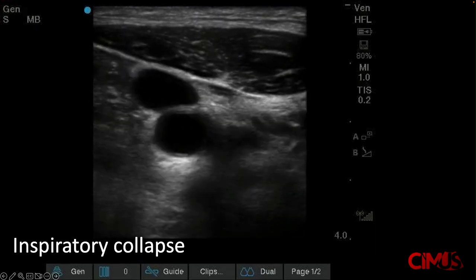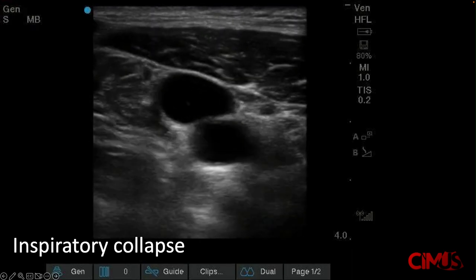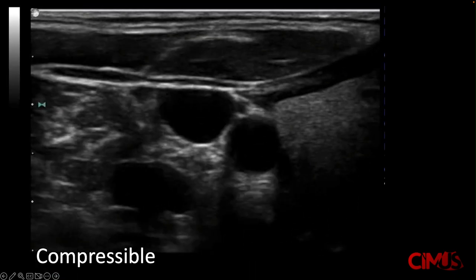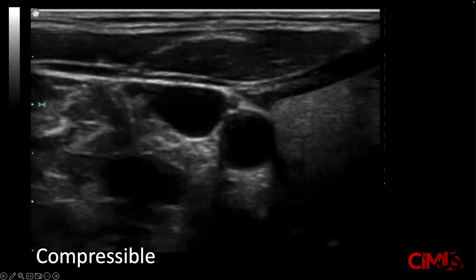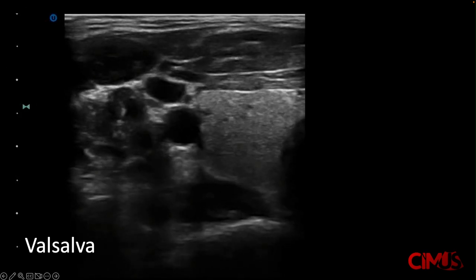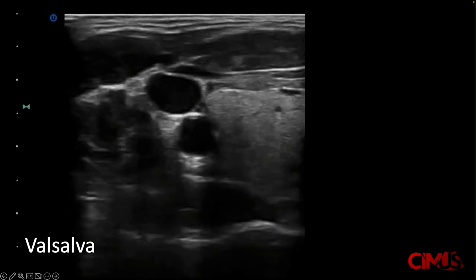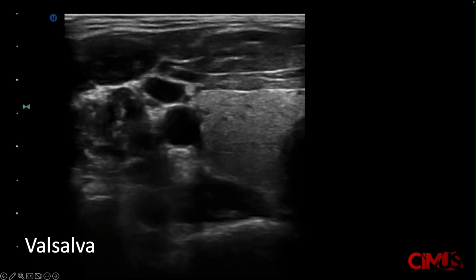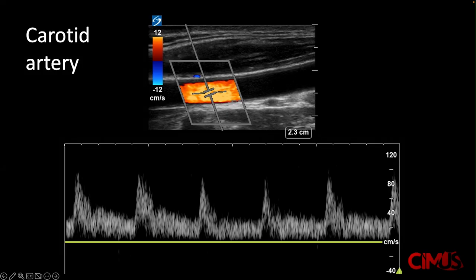You can confirm some of its features using ultrasound. For example, you can observe that it collapses or gets smaller during the patient's inspiration. If you apply pressure from the transducer, you can see that the internal jugular vein is compressible, while the carotid artery is much less so. If you ask the patient to perform a Valsalva maneuver, it should distend. In addition, adjusting the height of the bed will also result in a change in its size. For those familiar with Doppler functions, you can use spectral Doppler to see its waveform — the tracings from an internal jugular vein show double waveforms, whereas applying spectral Doppler to the carotid artery will demonstrate arterial waveforms.